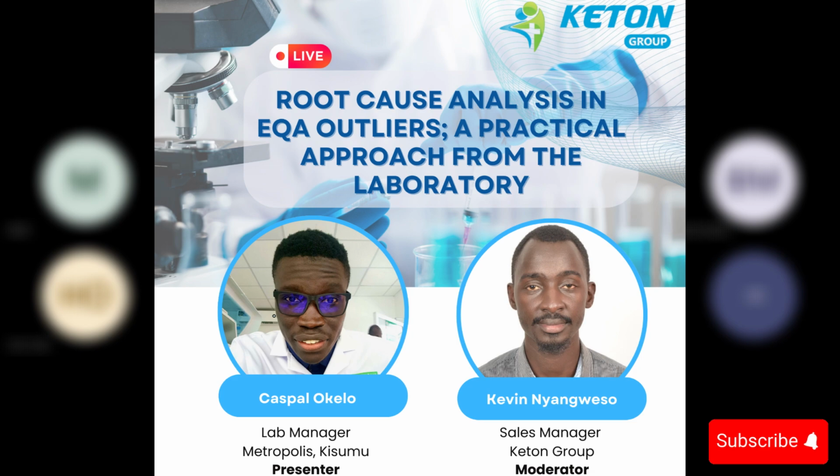I've mentioned that in monitoring the effectiveness of your CAPA, you use objective data and not opinion. So the first thing that you'll be doing is leveraging your charts to do your QC trend analysis: mean shift, trends, and stability of your standard deviation. Are there any Westgard rules violations? If the QC stabilizes and remains within limits, this is a good sign.